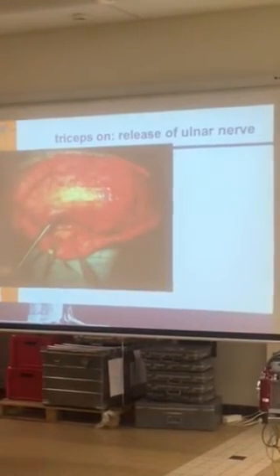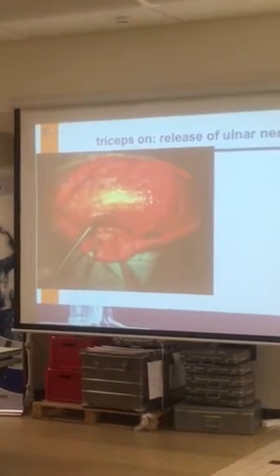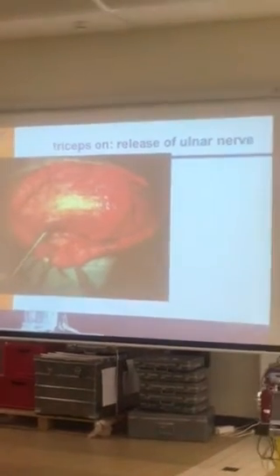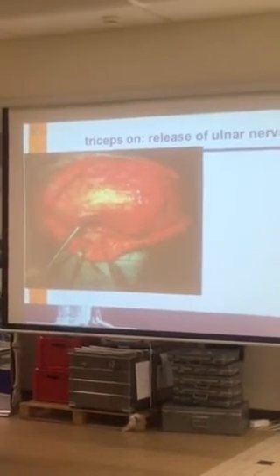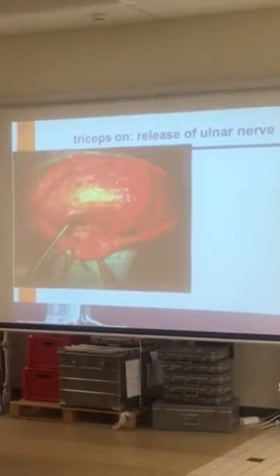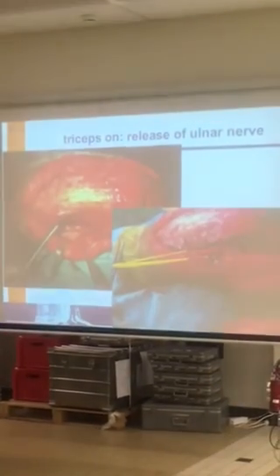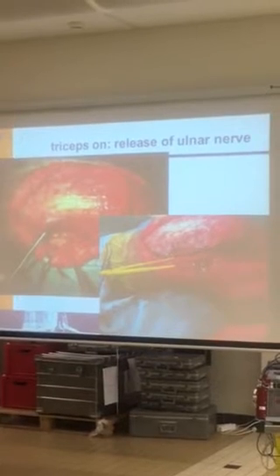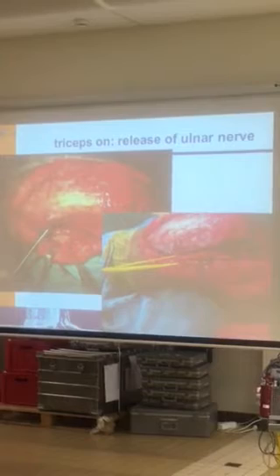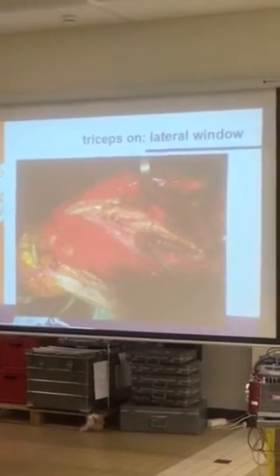What about the triceps-on approach? Still, the ulnar nerve is very important. So identify the ulnar nerve and put a vessel loop around it all the time. We never use a vessel loop with a clamp, because it's a bungee jump vessel loop. Bungee, bungee, bungee. So only a vessel loop with a knot, no clamp on it. This is dangerous. You see, someone is pulling on the vessel loop for the picture. I'm sorry for that.